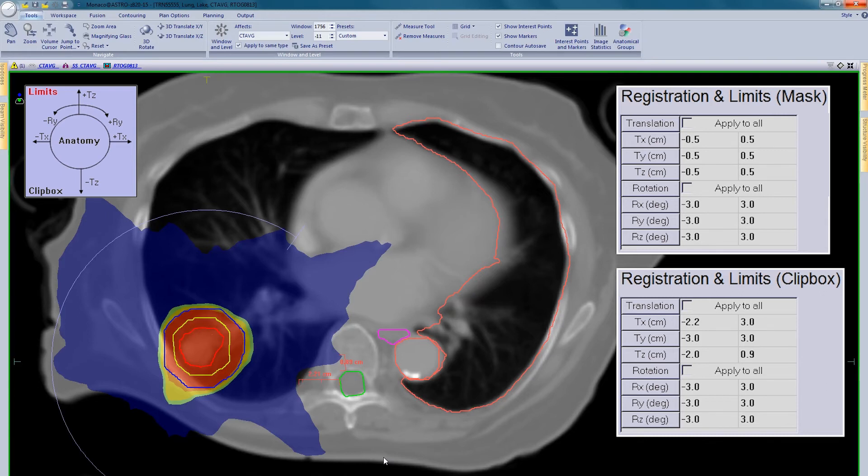The parameters have been inserted into the limits table for the clip box. The user will be alerted if these limits are breached, for example, if a mask or target moves towards the clip box or bony anatomy and exceeds the predefined limits.